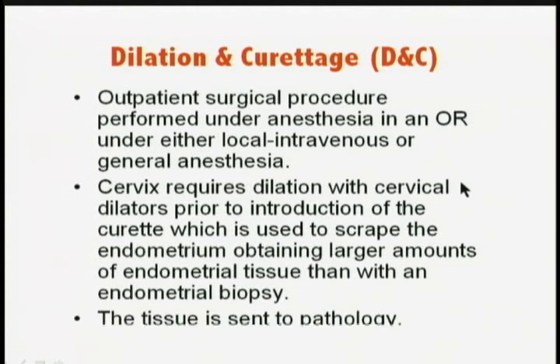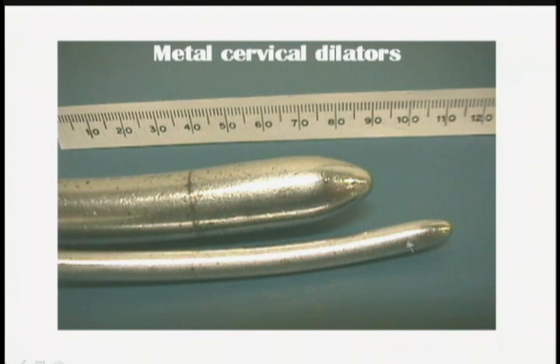You send the tissue to pathology for assessment for histology. Is it abnormal or normal? These are metal dilators. This is done for a minimal procedure. This is done if you want to dilate the cervix more.